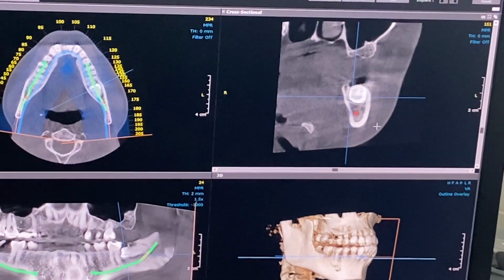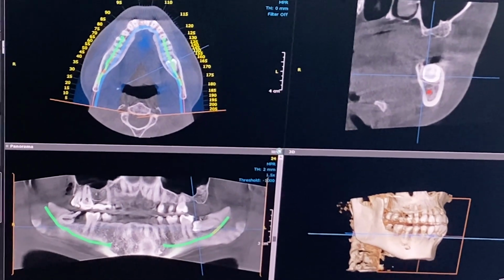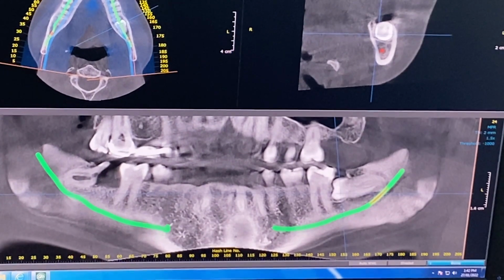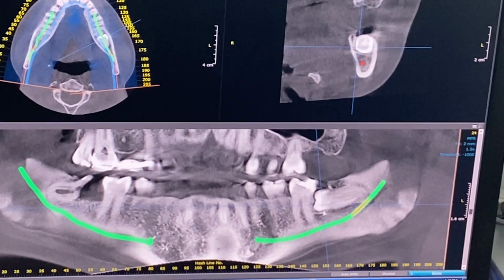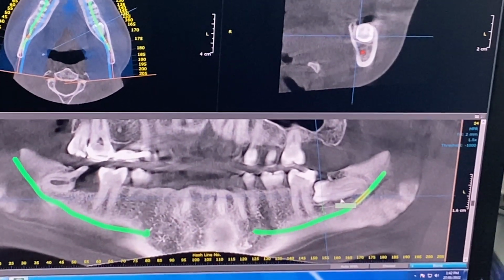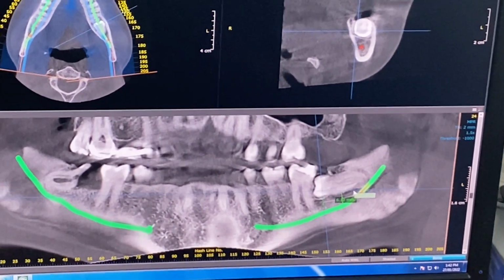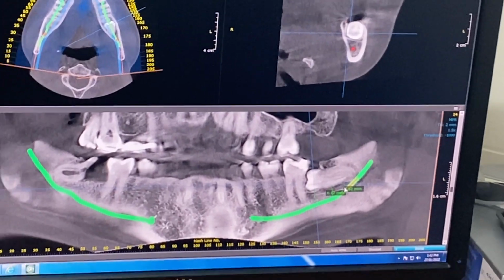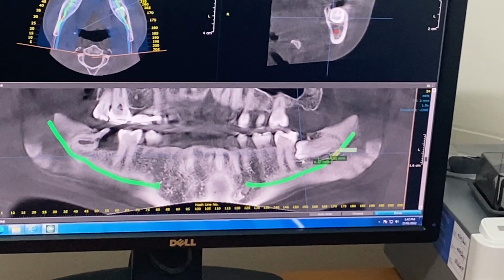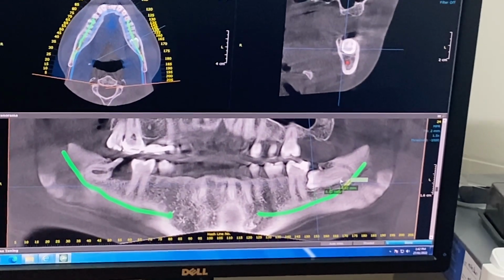And I like this technique where I can measure easily. I'll just make this a bit larger, Sean, and I can measure easily exactly where I am. I'm just going to my little measuring tool here and measure down from the bottom of the tooth. And so I know exactly where I am along the length, how far away I am from the nerve. And that gives me great confidence in setting the stop on the drills, how far I go down to section this tooth. So I'll do a distal wedge on here, section this tooth into probably 3 or 4 bits.